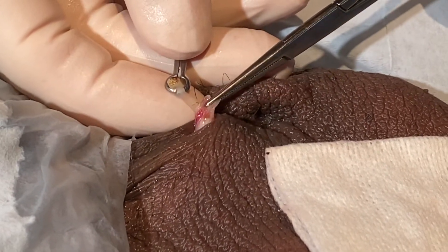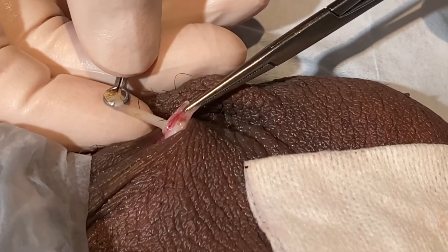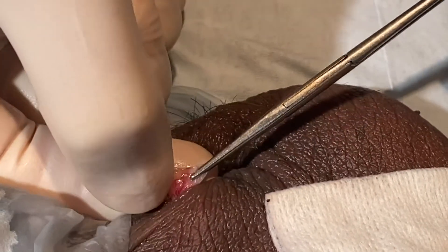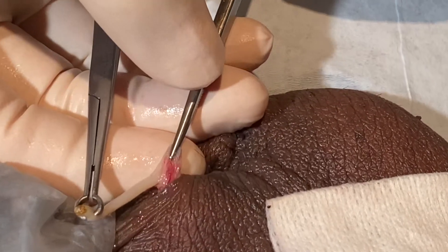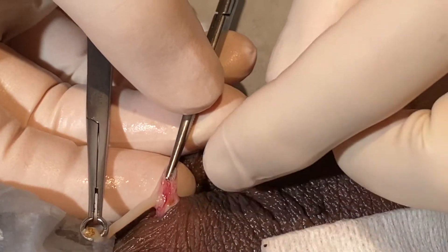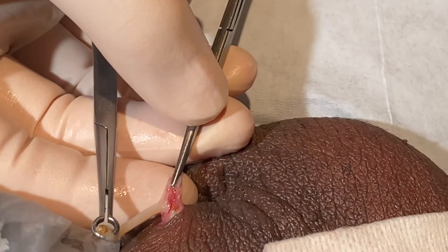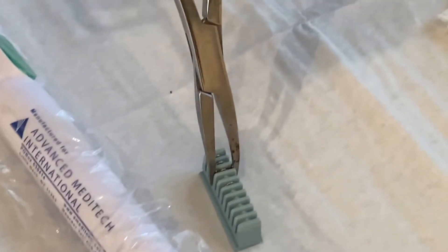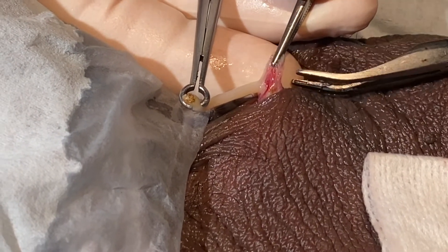Here I can see his vas going back. I could have left it like that with that distance between the two ends, but I like to lower the failure rate with good end separation. Sometimes I have to adjust because — if the abdominal end falls back in — it seems to really call for a clip rather than leaving it unsecured.